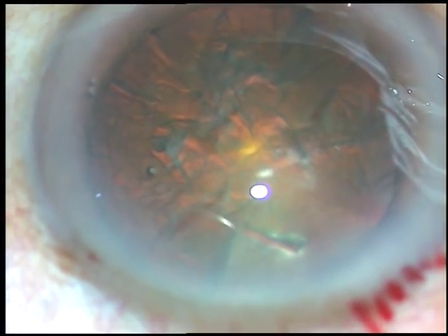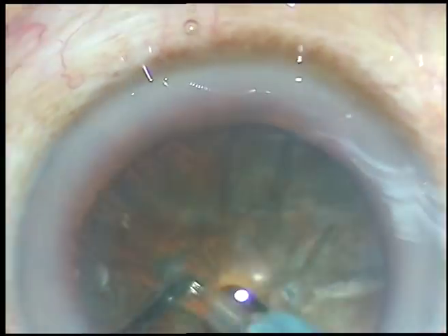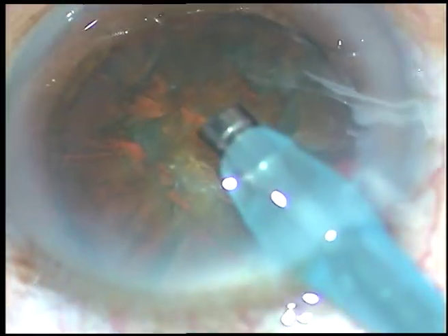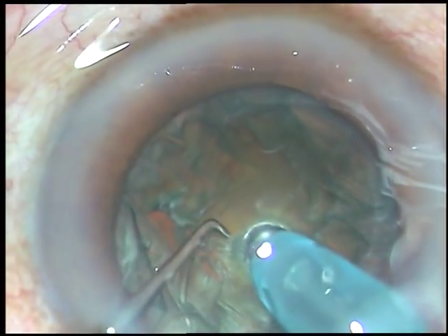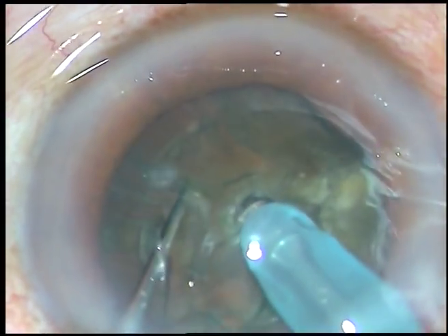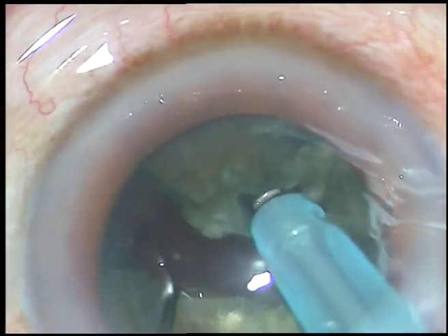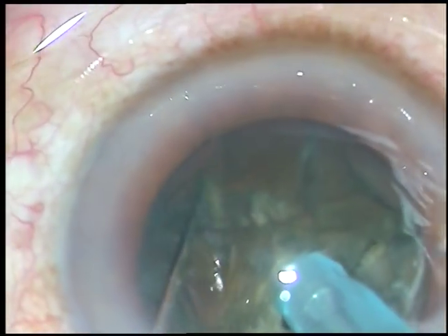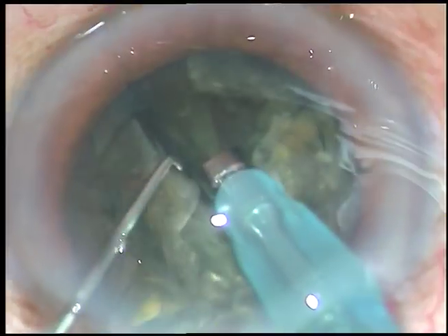Now is the time to introduce the tip of the FACO handpiece. This is the Oertli Catalyst 3 FACO machine and I am in FACO 2 mode from the very beginning — not FACO 1. FACO 2 mode means high vacuum, high flow rate, and adequate amount of ultrasonic energy. FACO power used in this case is 65%, flow rate is 45 ml per minute, and vacuum is 450 mmHg.